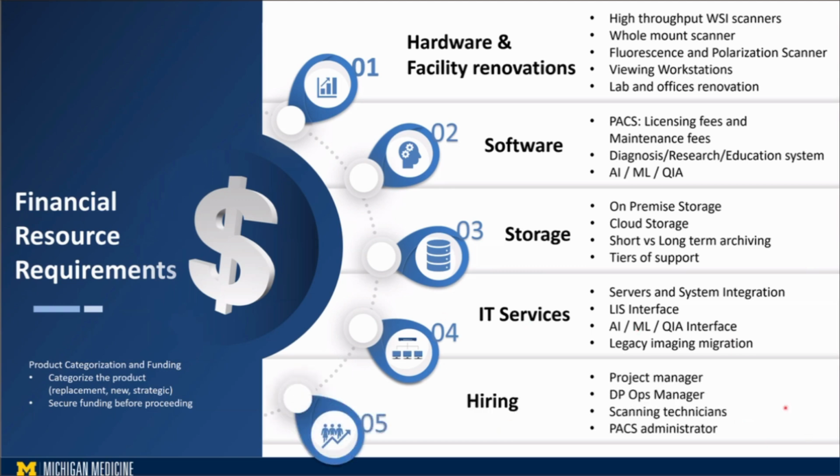Hiring is extremely important in case you don't have a project manager. Some of you maybe don't even have a DP manager that you need to hire. Scanning technicians as well. We put into account the number of staff that we need to run this slide, and the PACS administrator. This is separate from the project manager or the DP operation manager, because this is only going to work in that image management system to focus on QC, case assignment, etc.